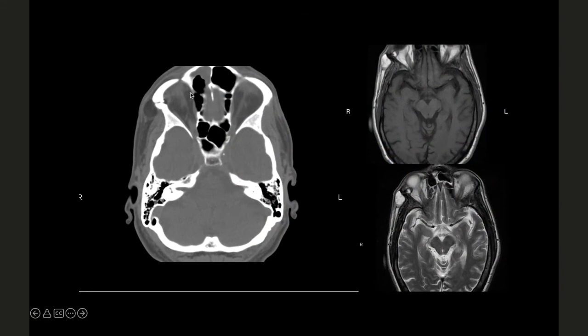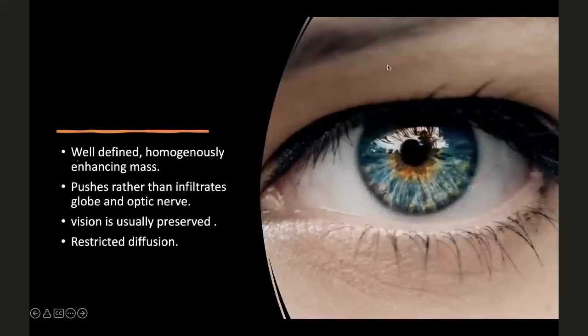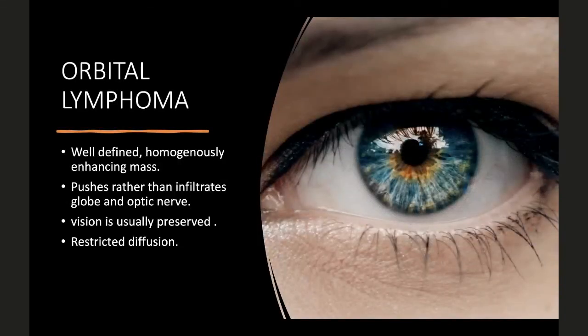And then if I look at my MR, if the fat is not suppressed, it's going to be bright. If I have a fat suppressed image, it's going to be dark. So I know it's a lipoma. Dermoids can also have fatty components, but they also tend to have calcifications and other things, right? Because they have different components of the dermis and the epidermis, depending on if it's epidermoid or dermoid.